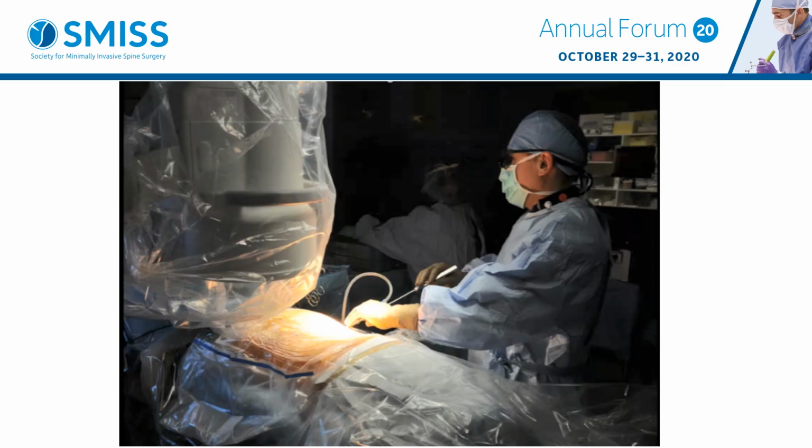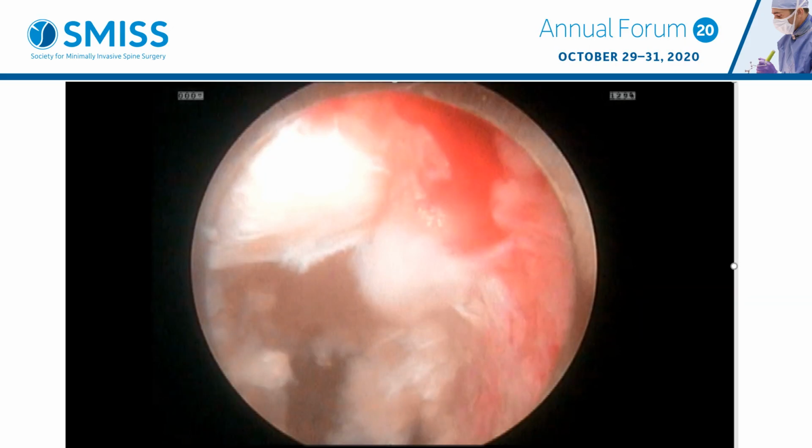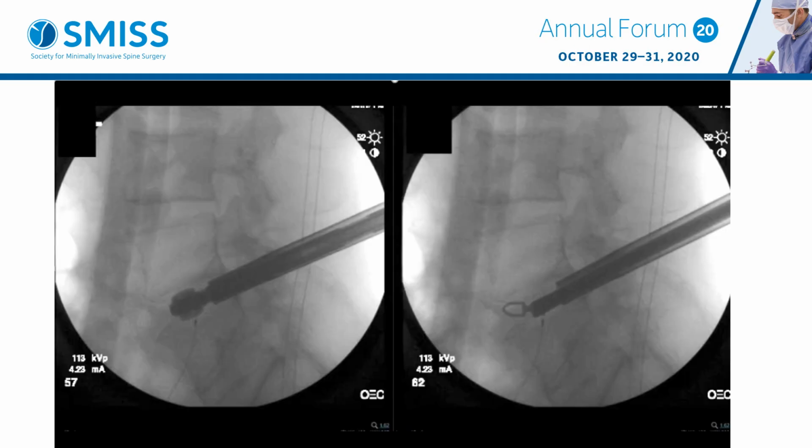And this is a photograph of me with the ball probe. This is after the endoscopic decompression. We can see the pedicle on the right in the neuroforamen with the disc below.